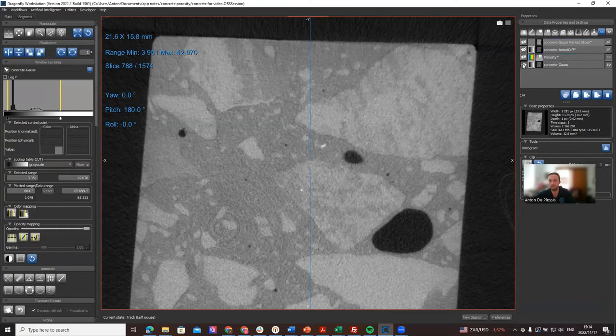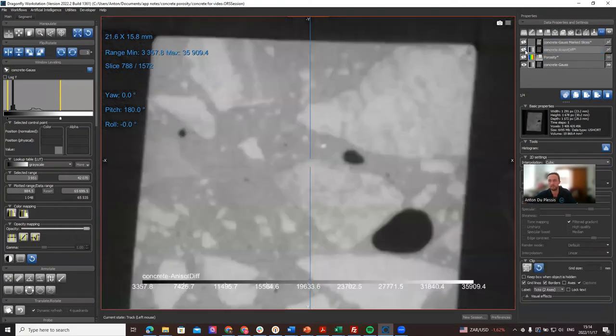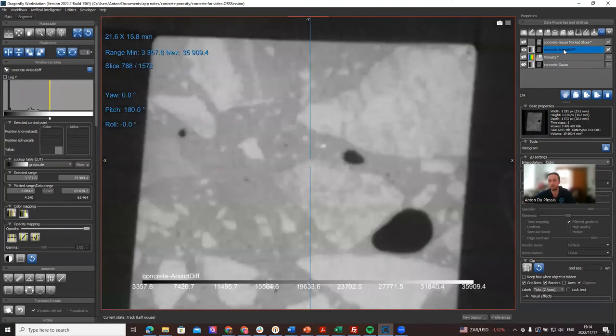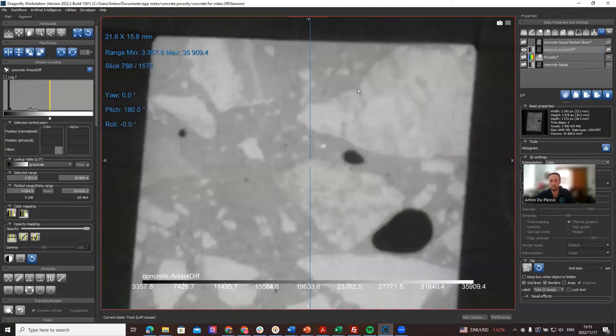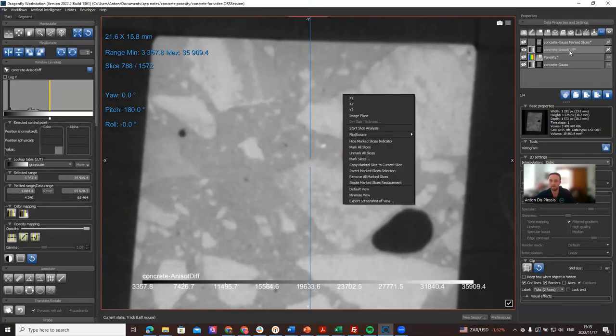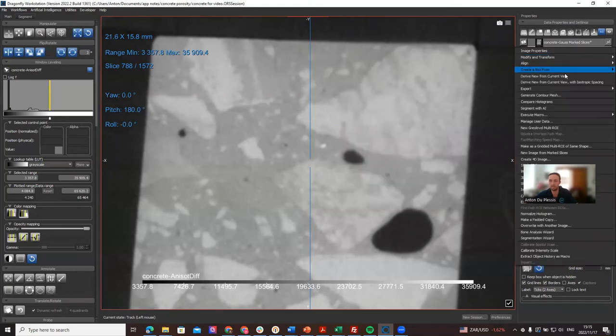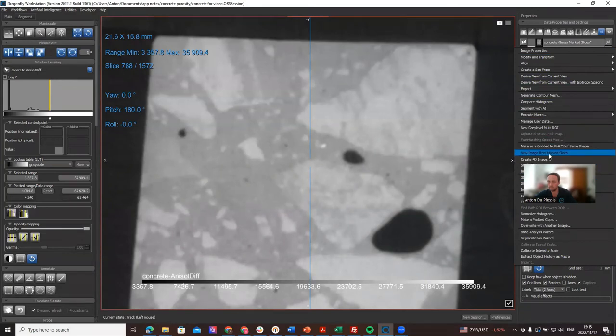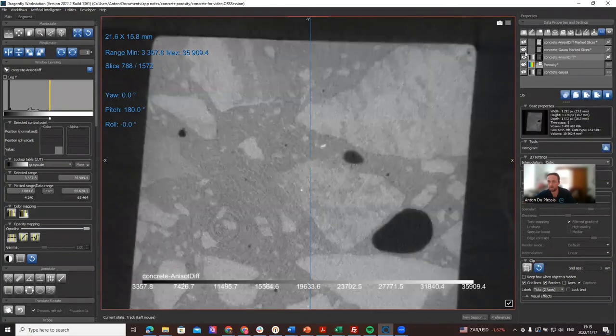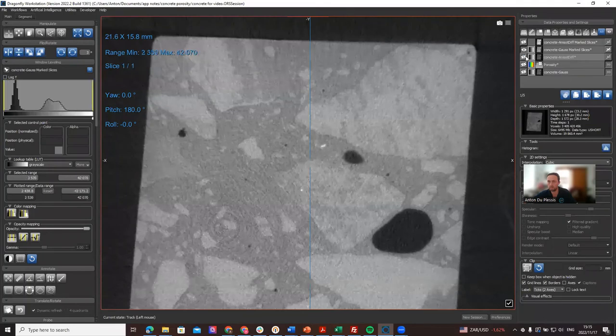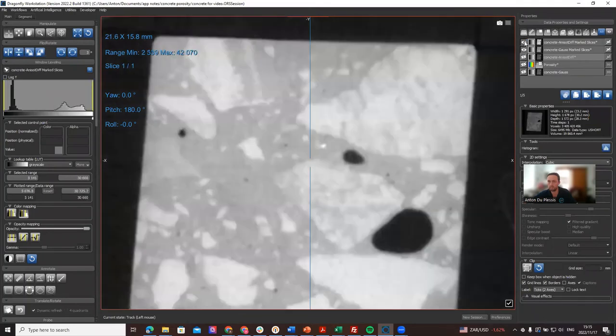If we go to the second dataset which is blurred out, we want to mark the exact same slice. Let's just hide and show the marked slices indicator and we click on that tick box, and then on the image itself we can make a new image from marked slices.